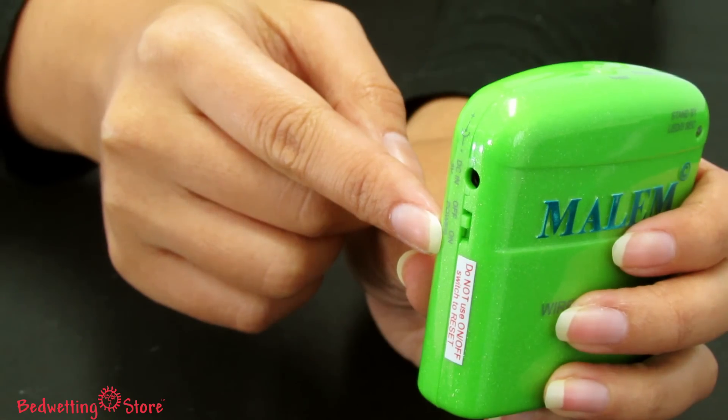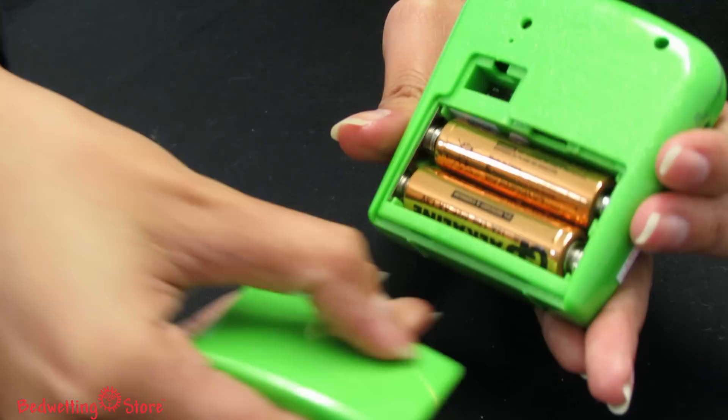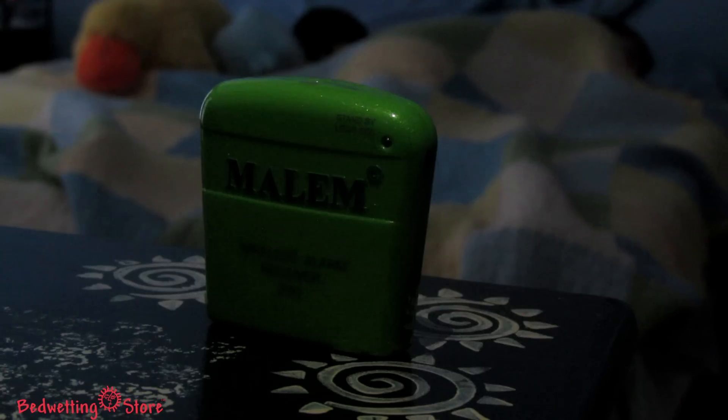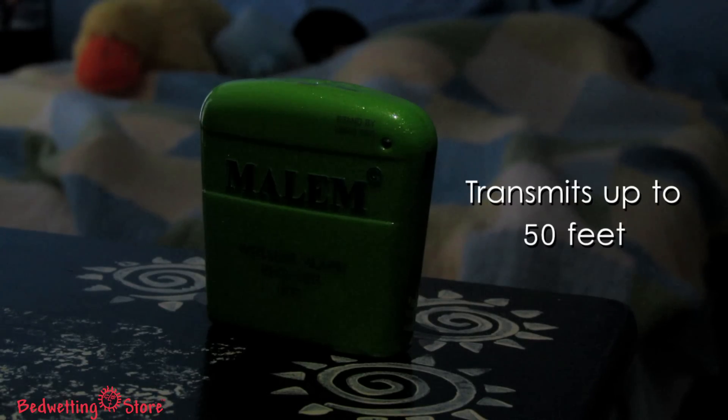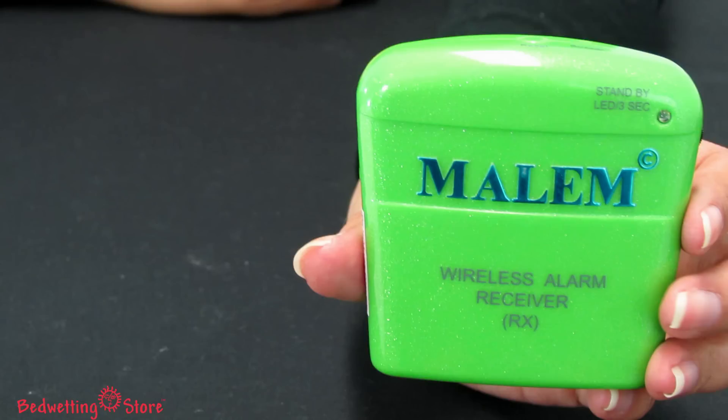Next, turn on your wireless receiver unit using the on/off switch on the side. The receiver unit is powered by two double-A batteries and can be placed by your child's bedside table or dresser. The alarm transmits up to 50 feet.